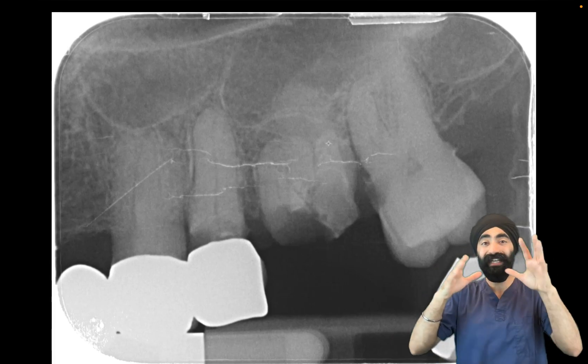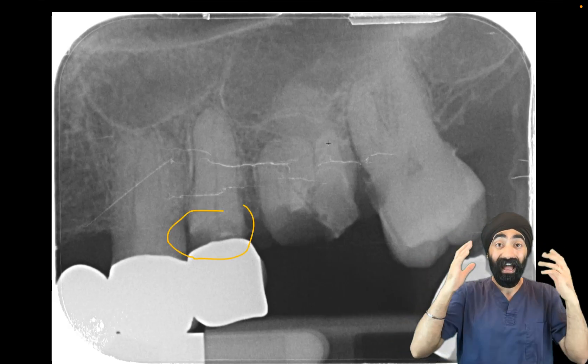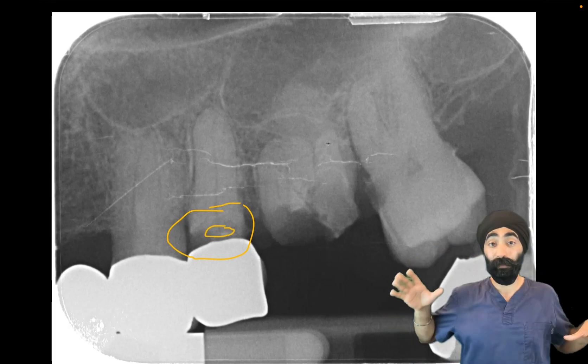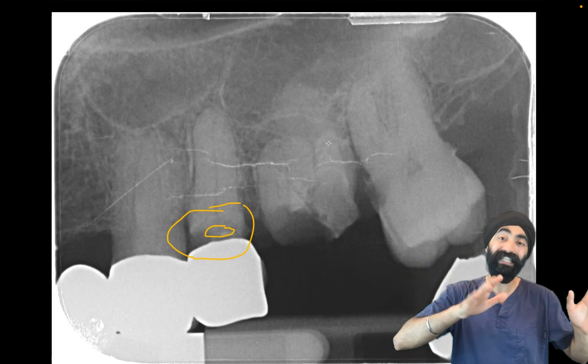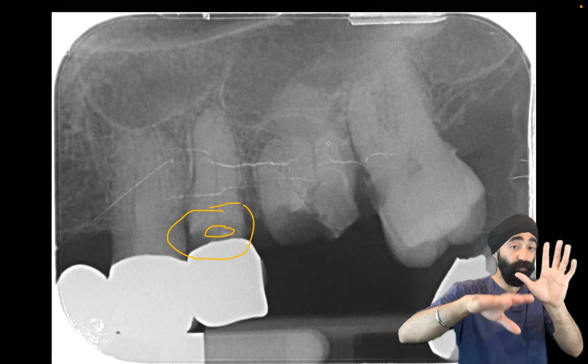Two big issues here that we take care of: this is a 71-year-old patient who's otherwise medically fit and healthy. Have a look at the mess of this upper left second premolar — this caries mess here. I tell the patient that you could sneeze and this tooth can break away; we need to extract it. But she wasn't ready yet to have this one out, so we're going to come back and do some treatment plan discussion. That's why it's still in there.